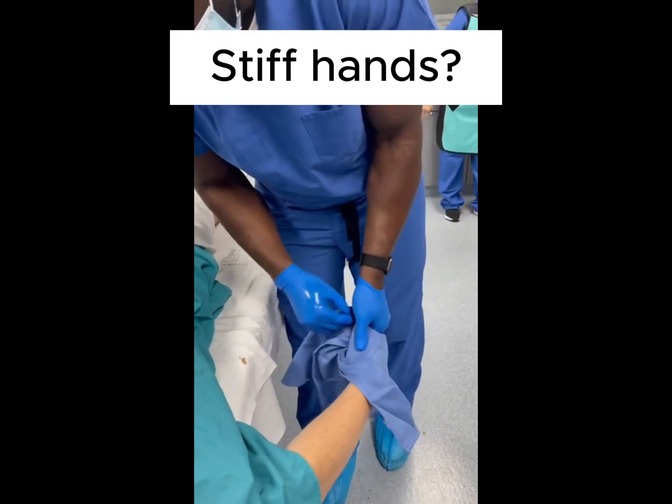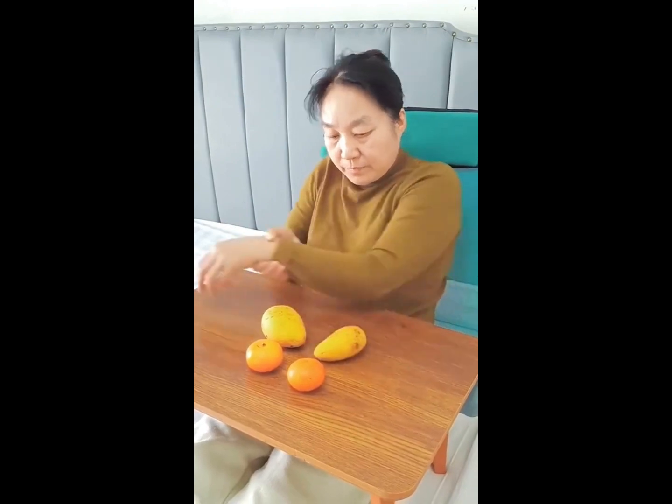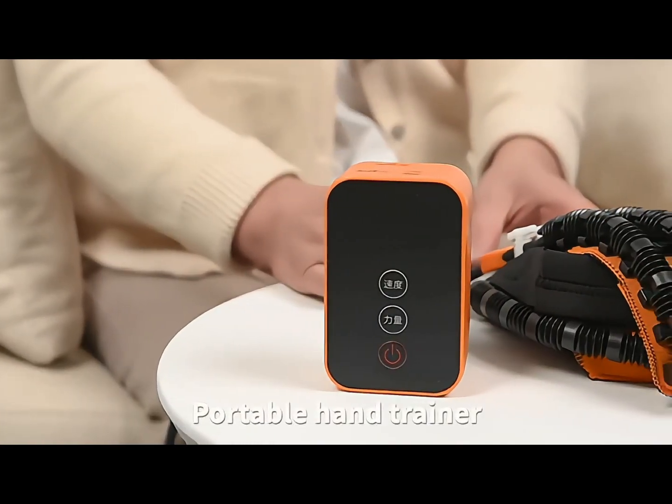Stiff hands. Can't control your hands. Can't grab things. Introducing the portable hand trainer.